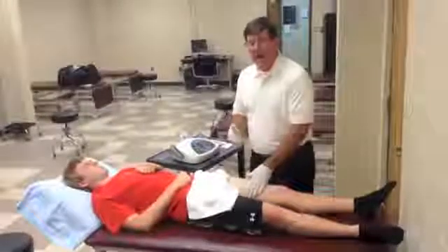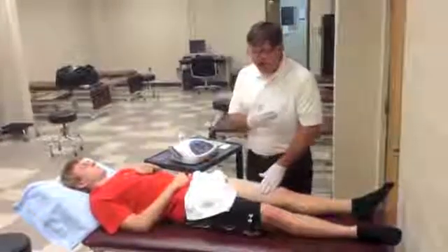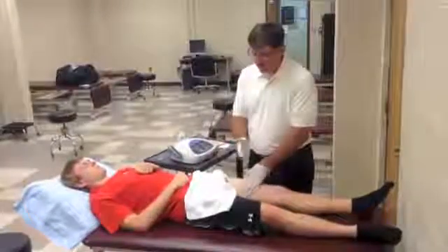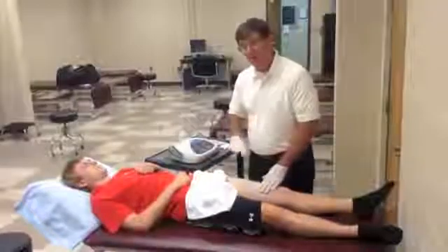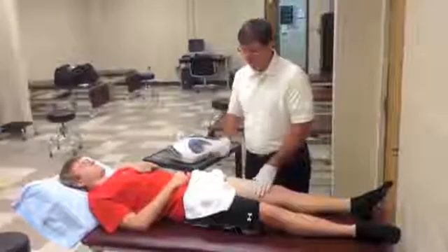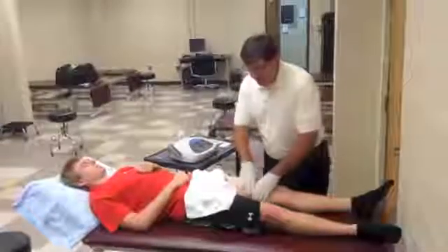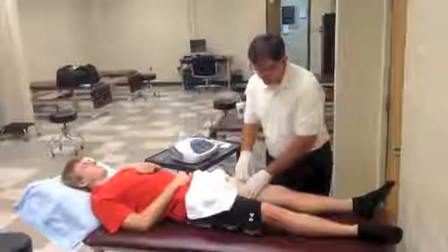When I'm negative I will attract positive ions in the patient, and when I'm positive I will push away those positive charges, and what we get is an oscillation in the tissue.